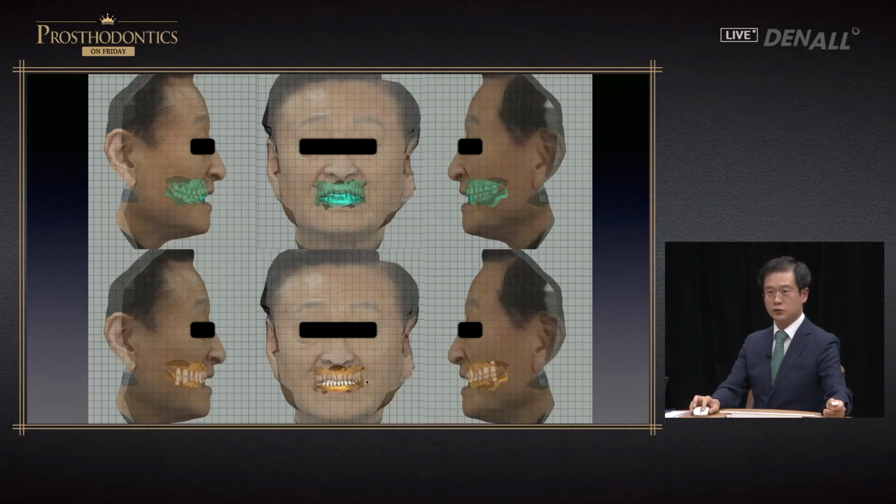As shown below, when you do the diagnostic design, I use the virtual articulator mode. I do not use the patient's movements. I only use opening and closing. The condyle angle and Bennett angle are set on the virtual articulator.